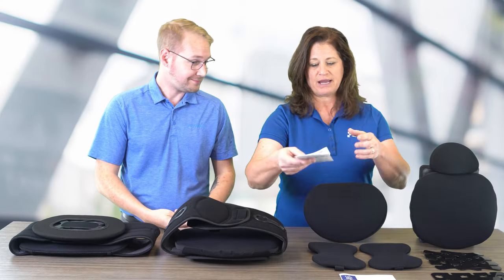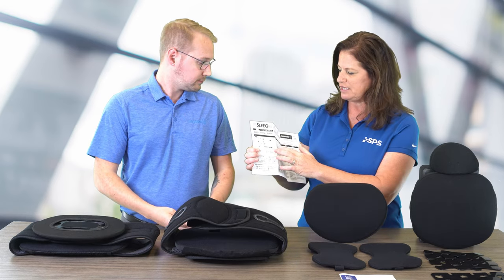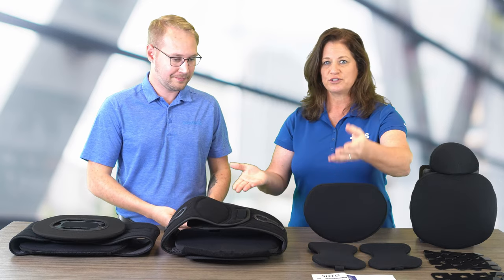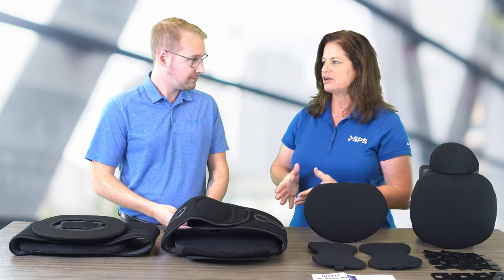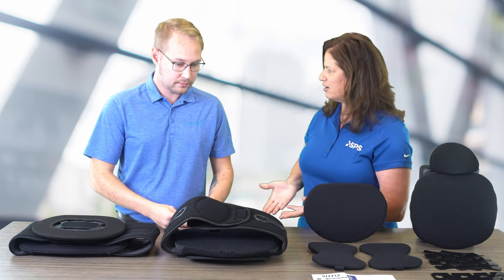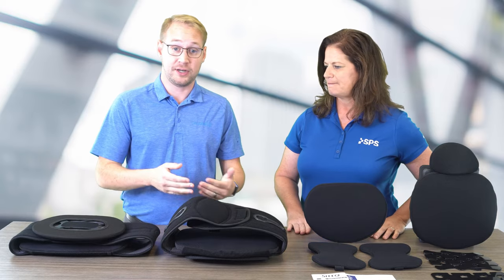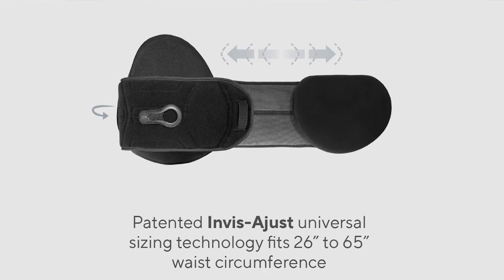Inside each packet is an instruction sheet that indicates how to adjust all of these straps. These are universal in sizing, so that limits the amount of products on the clinician's shelves. And Jack, do you want to show us how they are adjustable? Sure. For inventory management, it's great to have one device that you can adjust up or down based on the patient's waist circumference.